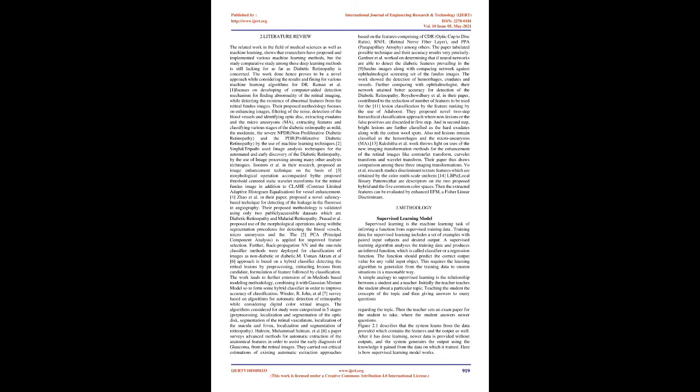Usman Akram et al.'s approach is based on a hybrid classifier detecting the retinal lesions by pre-processing, extracting lesions from candidates, and formulation of features followed by classification. The work leads to a further extension of the m-Mediods-based modeling methodology, combining it with a Gaussian mixture model to form a hybrid classifier in order to improve accuracy of classification.